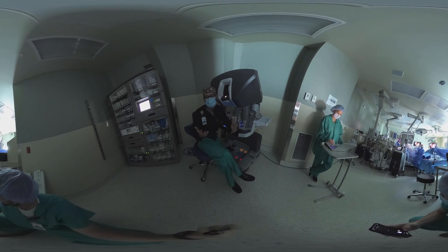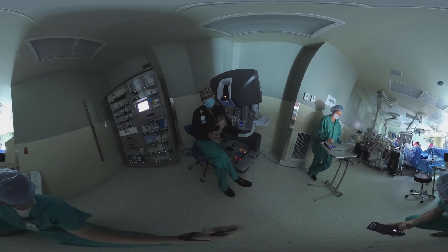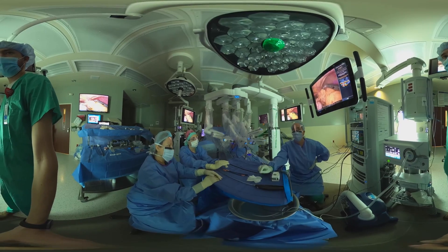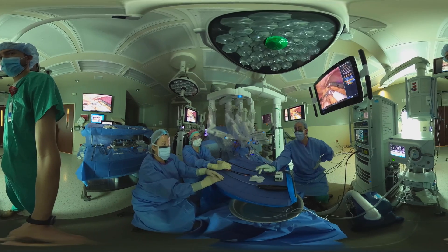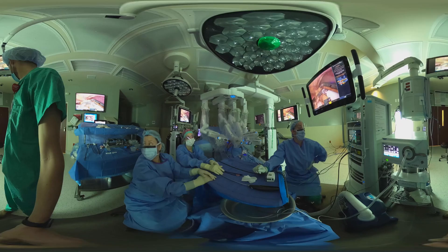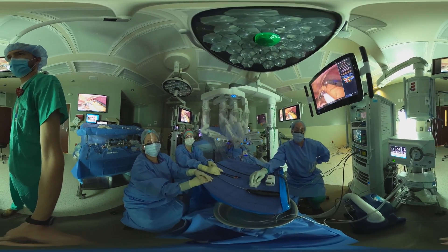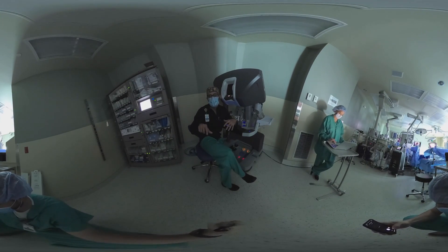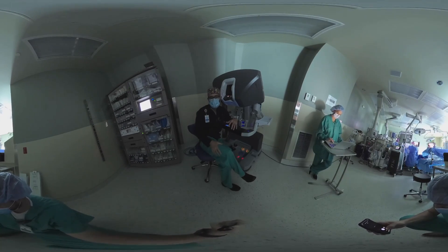The surgery has basically three or four parts. First, I suspend the liver out of my way using a piece of suture. Next, I free all the blood vessels that go along the greater curvature along the left side of the stomach. I free up all the nourishing blood vessels, and then, once the whole stomach is free from all its connections, I introduce a sizing tube inside the stomach and fire a series of staples through the body of the stomach in order to cut and remove that portion.